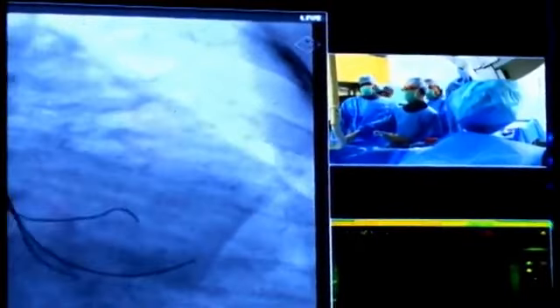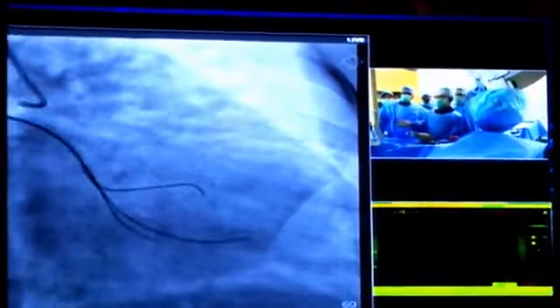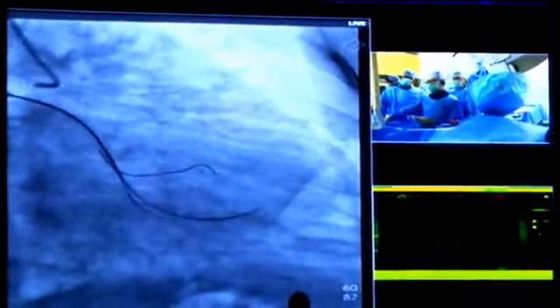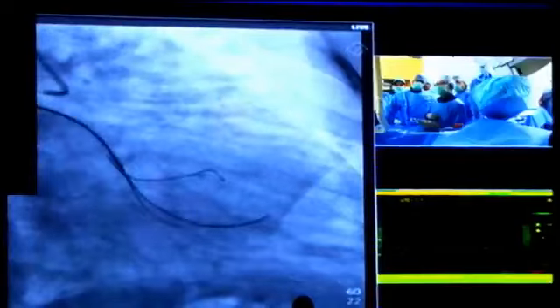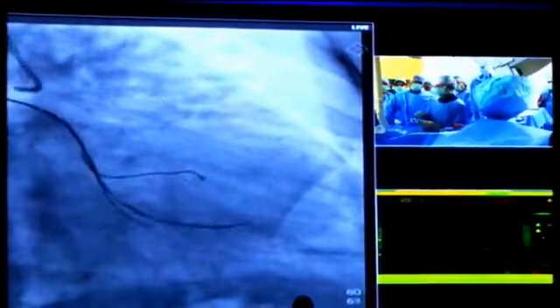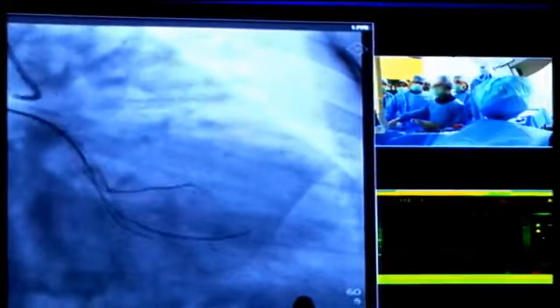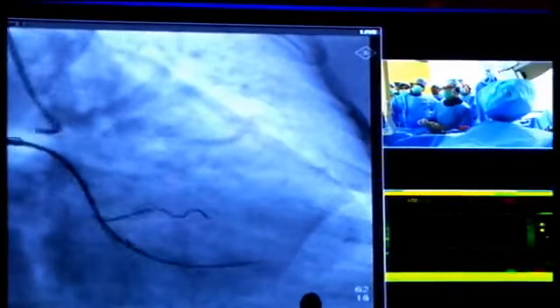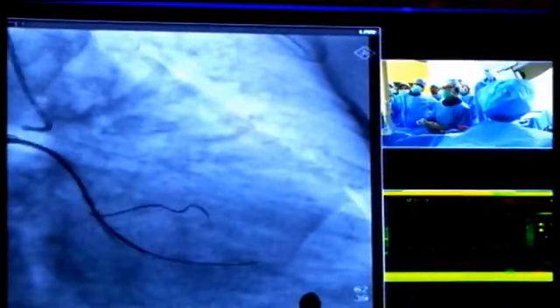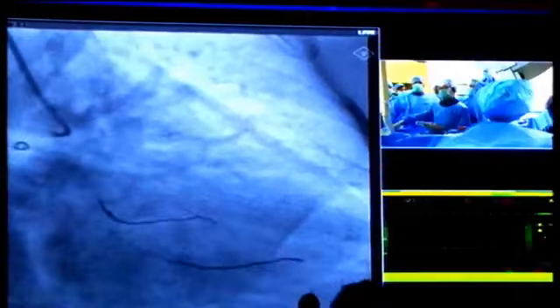Corsair 135. That's why I use the Corsair. As you know, the Corsair has a dilatation effect, like a 1.0 millimeter balloon dilatation, so I was afraid of creating a big dissection at the bifurcation. If a big dissection were created, it would be very difficult to insert into the circumflex and another guide wire. After passing the Corsair, I took the Corsair and dilated, and amazingly the double lumen microcatheter passed through this CTO region without balloon dilatation.